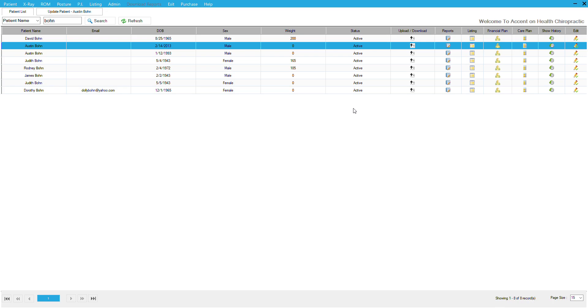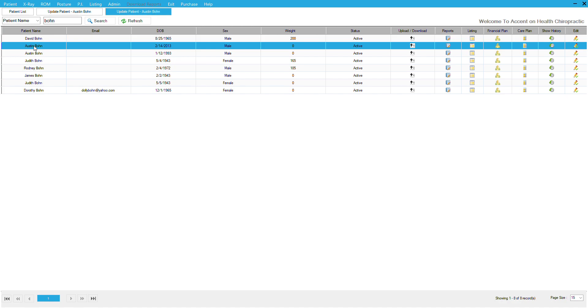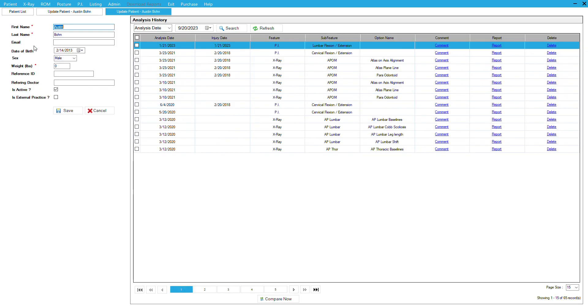Let's go over how to do a comparison of two images. In this case, we're going to compare flexion extension cervical images. I'm going to open up the patient's file by clicking on the patient's name, and this will show all the images and studies that have been performed.